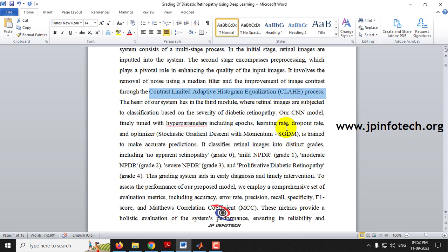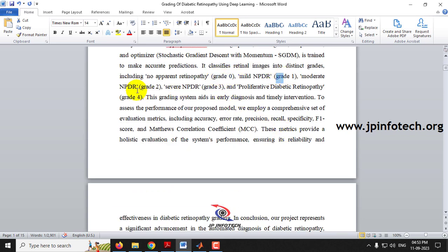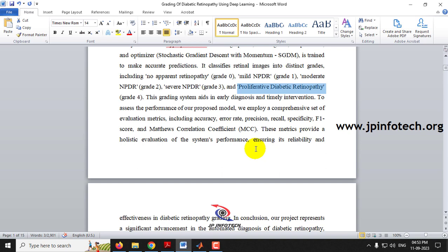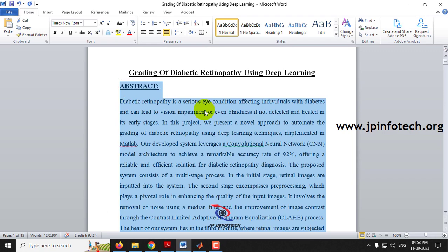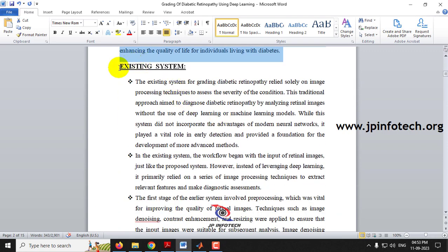The CNN model classifies retinal images by severity into five grades: Grade 0 (no apparent retinopathy), Grade 1 (mild), Grade 2 (moderate), Grade 3 (severe), and Grade 4 (proliferative diabetic retinopathy). This grading system supports yearly diagnosis and timely intervention. Performance analysis includes accuracy, error rate, precision, recall, sensitivity, F1 score, and Matthews Correlation Coefficient (MCC).